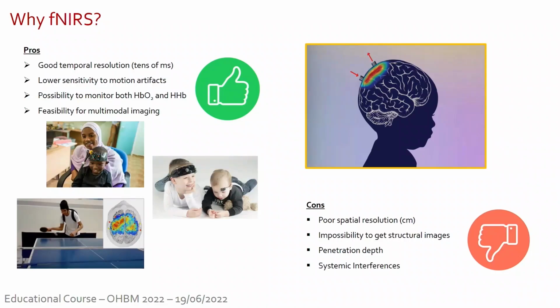And it's very easy to combine fNIRS with other modalities. It's often paired with EEG, for example, if you want another measurement of the neural activation, or any other technique, for example, eye tracking, EMG, electromyography, BioPac system to measure physiology. It's very easy to pair fNIRS with other methods.